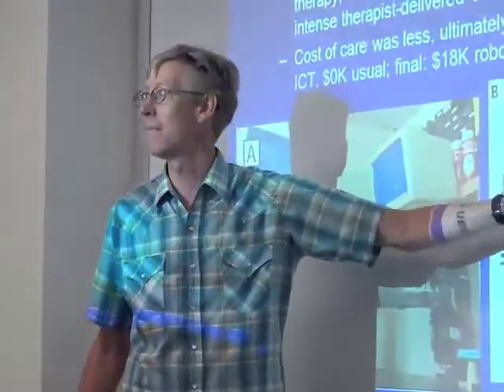Let's see, I was going to say something else. Oh, the cost, yeah. This robot's pretty pricey. It's about $100,000 for just this part. And they had a vertical module and then a wrist arm module. So they did a big cost study, and it turned out that the cost of these two things was about the same. But that's largely because the robots are really expensive right now. And probably if you make robots that are less expensive or you sell more of them, then it'll become more cost effective.